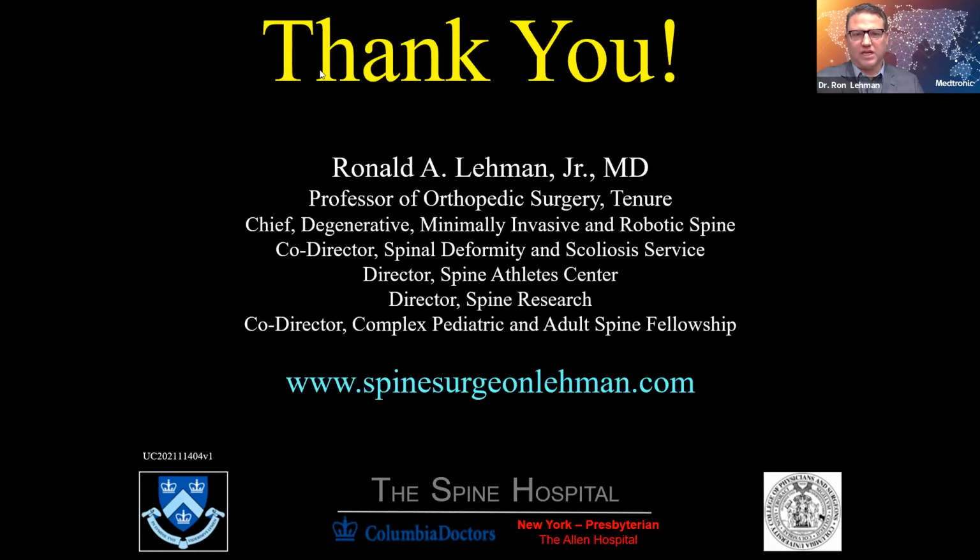Yeah, I think it's a great point too. One of the things that I found by placing the implants first, which I do now with robotic assistance, as opposed to where I used to do it, is that when you have the screw or the screw shank in the pedicle, it basically lights your way to go down. And so it tells you exactly where the interbody space is going to be, whether it's a primary case or a revision case. And you go right there on top of the pedicle. You don't need any fluoro.